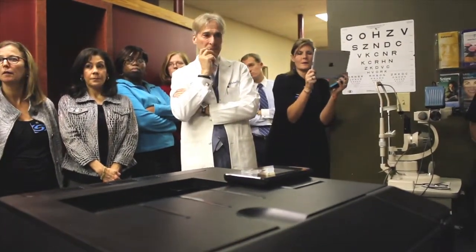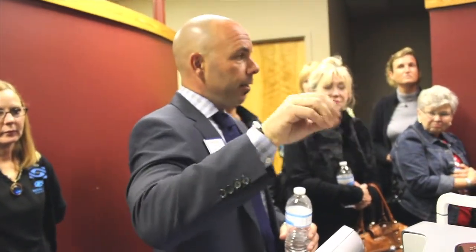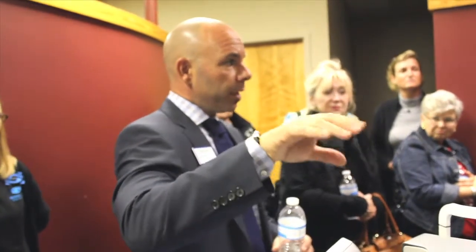If I could chime in, basically what this device is doing now is unclogging those glands. Now you realize these glands that are clogged haven't worked correctly in a certain period of time. So not only are we liquefying that oil, then we'll start to clear it out. As this device continues, and you'll hear it start to do multiple pulses shortly, it's using warm heat to squeeze the glands, sucking out that clogged pore and really starting to get it working the way it should. Post-treatment, each and every day, that gland, you've got to realize it hasn't worked in probably quite some time. And now it's going to start working.